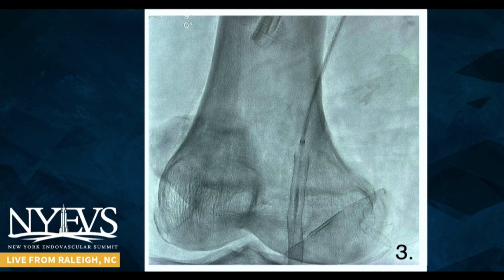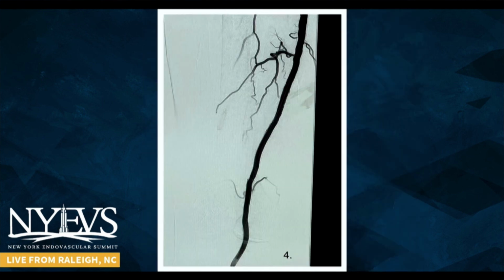We were then able to lay 2 Supera stents. We pre-dilated the popliteal and SFA with a 6.0 balloon to make sure it was adequately prepped, and then placed 2 Supera 5.5 by 150 Superas. And I just show you this picture to show I stacked it pretty well to give you that radial strength. Next slide, please. And then as you can see, this is the final result.